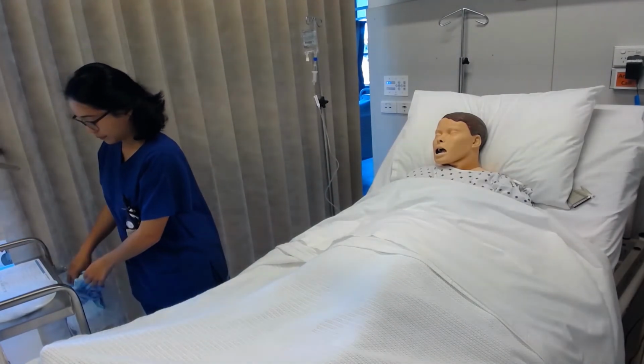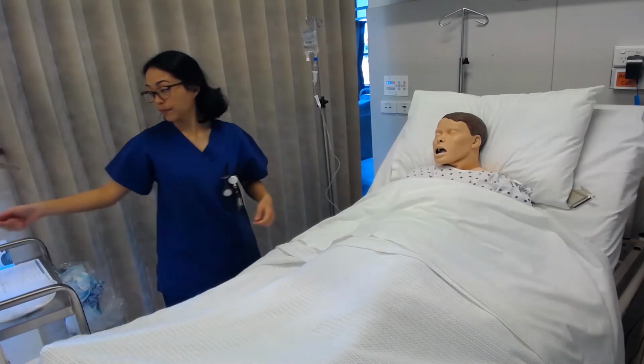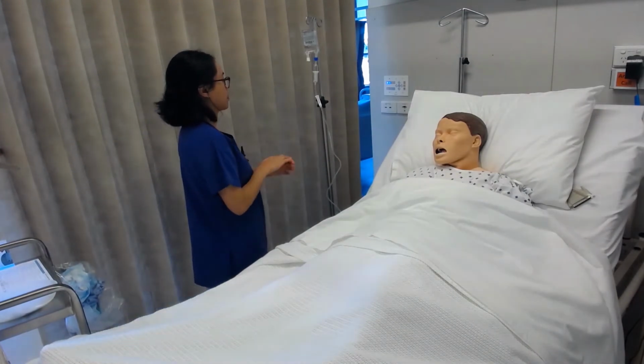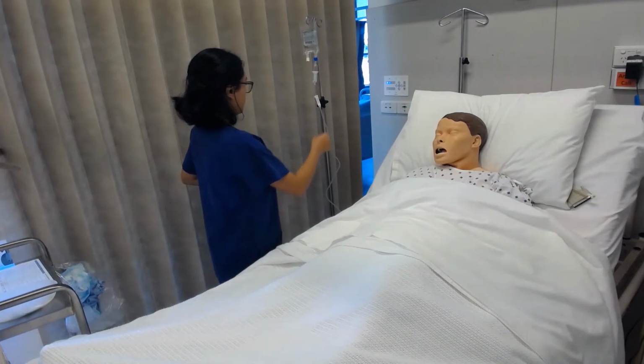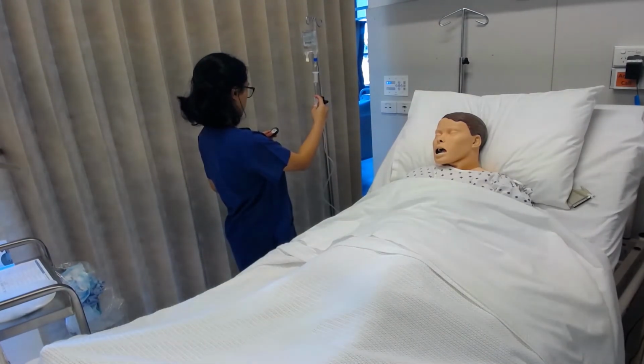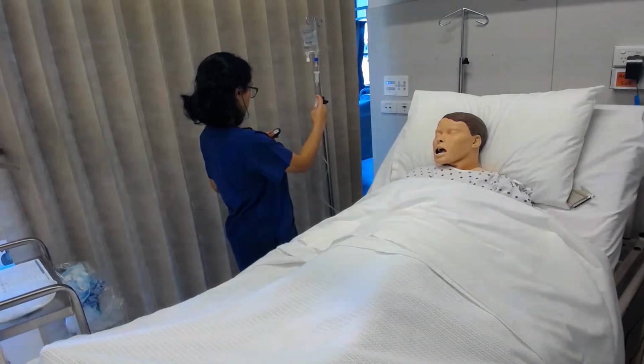You can now set your rate by watching the drops as they fall inside the drip chamber, comparing to the second hand on your watch and controlling the rate using the roller clamp. Ensure your drops per minute rate is accurate.